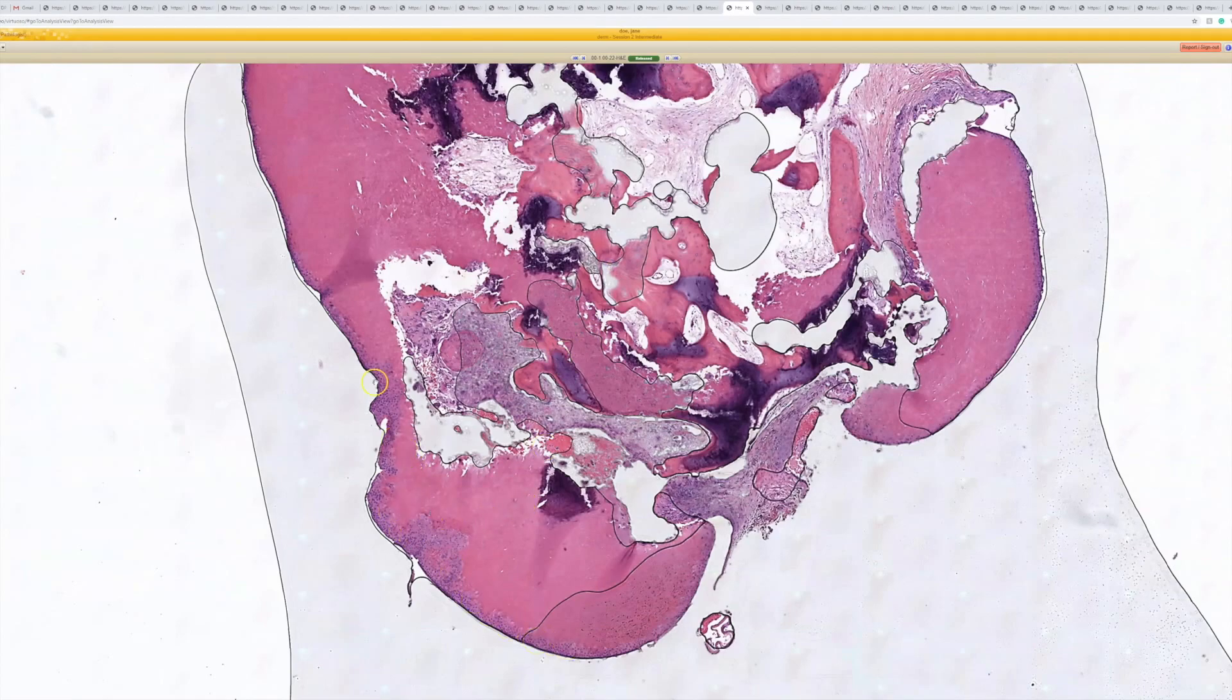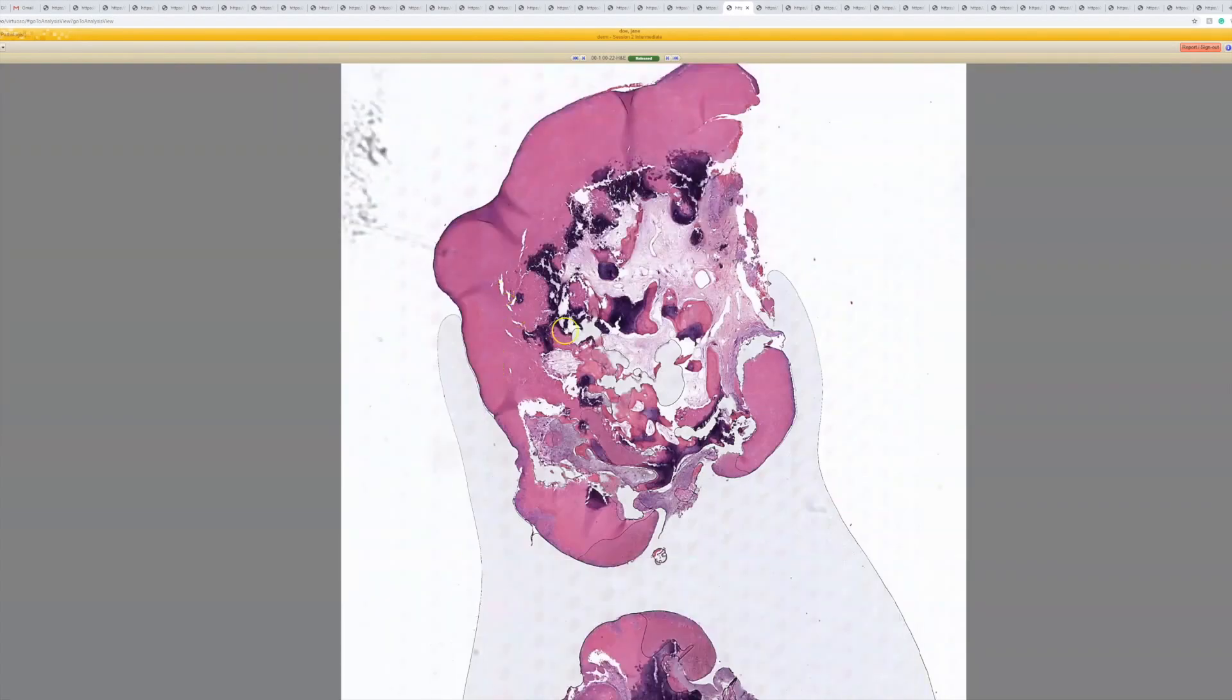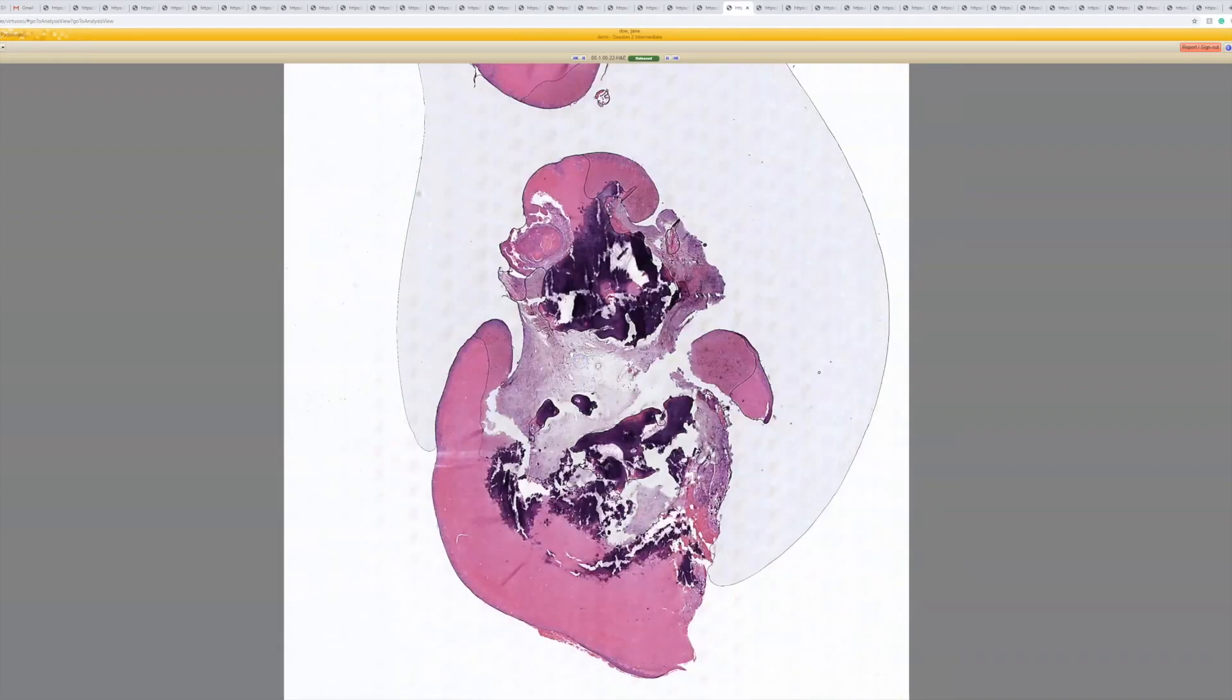But here we've got the nice pilar cyst lining. So this is a pilar cyst or tricholemol cyst with metaplastic bone formation and calcification. Really nice example.